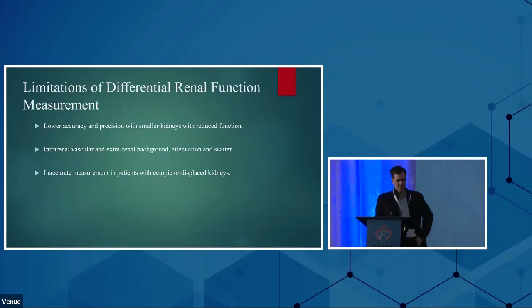Now there's limitations. There's lower accuracy and precision with smaller kidneys and with reduced function. There's intrarenal vascular and extrarenal background, attenuation and scatter, and there's inaccuracy of measurement in patients with ectopic and displaced kidneys. But there are ways to overcome that.